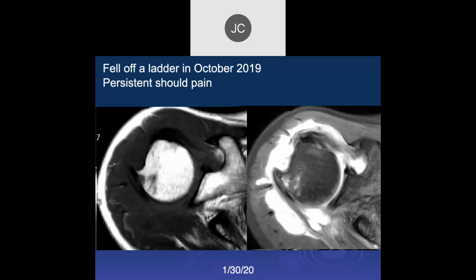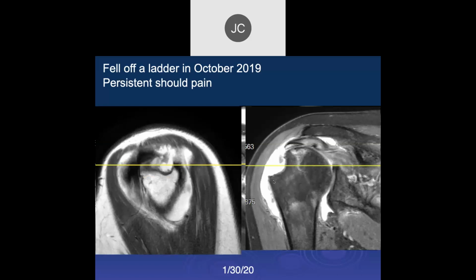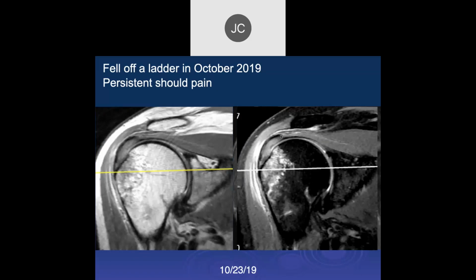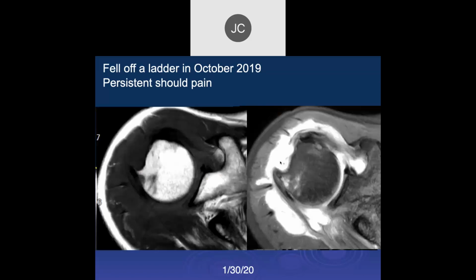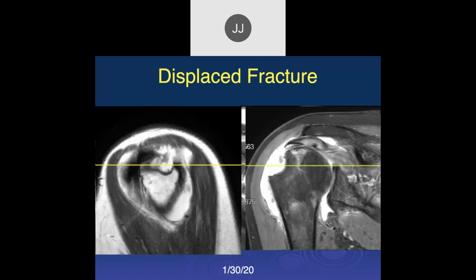Right, so some scalloping of that humeral head, and looks like there's a bone fragment that's displaced by maybe the supraspinatus tendon. Right. That's more than one fracture. And then a lot of tendinopathy within the tendons, both the supraspinatus and infraspinatus. So this was probably an avulsion injury here that then they kept putting stress on it, and it didn't heal. In fact, it fractured, and then the bone displaced.